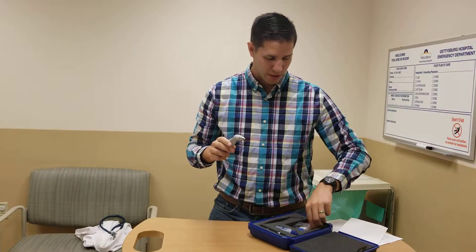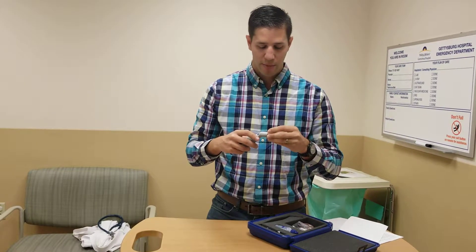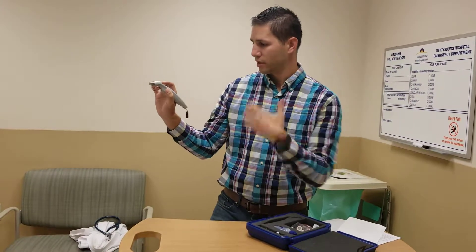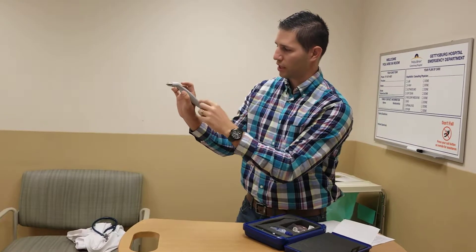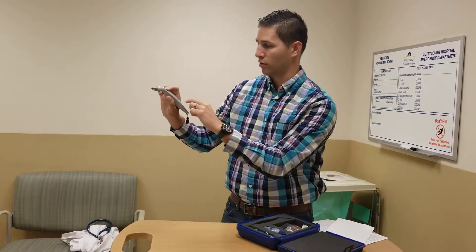At this point, go ahead and take a probe tip — of course, use a new and sterile one for each new patient. Place that over the top, then hold it just like so and press the action button to get back to the main screen. Now to take the pressure, hold it horizontal to the patient's eye and press the action button. You'll get a spinning indicator at the bottom, then tap the eye at about once per second, maybe three to five times. After that, it should beep several times and give you the reading.